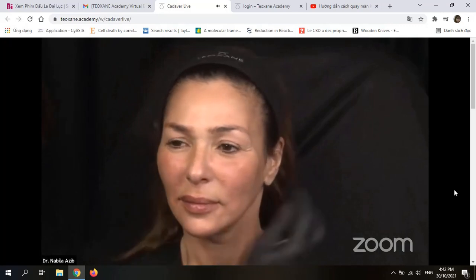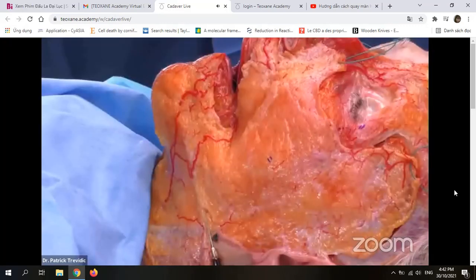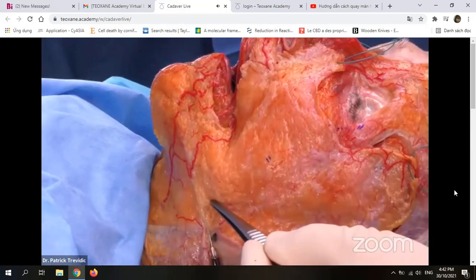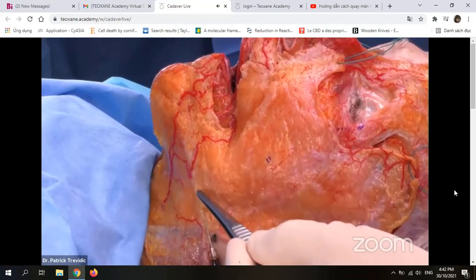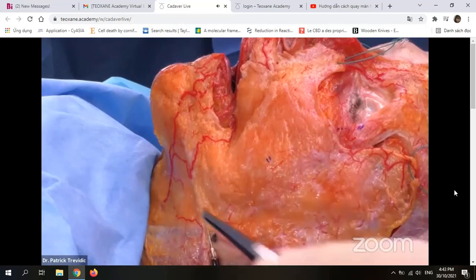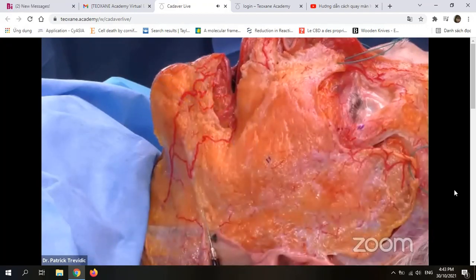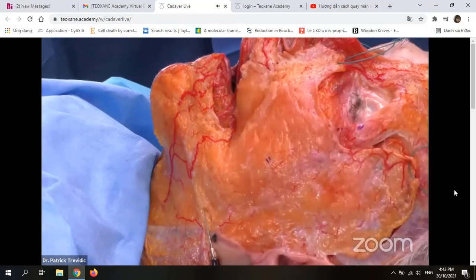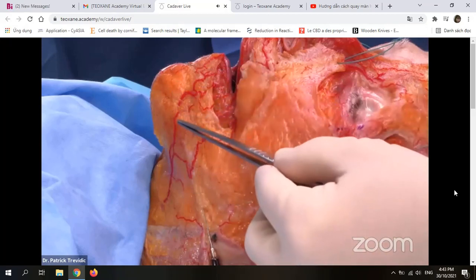Patrick? Yes, Ludmila. So here we are on the cadaver. I will do a multi-layering technique like Nabila did in the jawline area with the Texas technique. Then I will move to the chin to do the multi-layering technique, and I will finish with the lips. So here you have the superficial fat, with some superficial vessels.